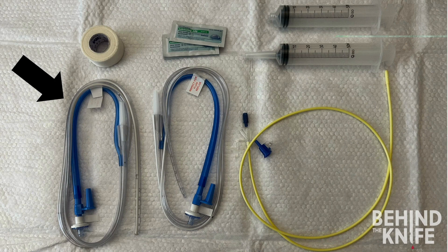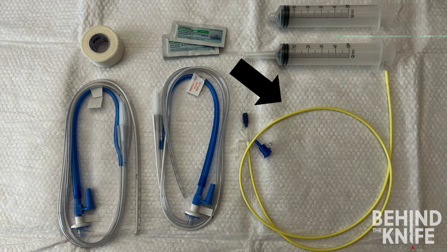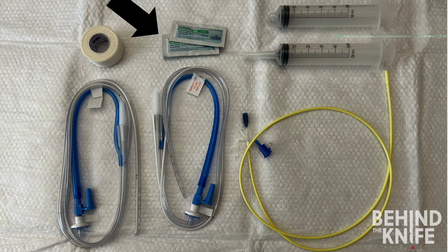The sump allows air into the stomach to prevent the tube from getting stuck against the stomach wall. The other type of tube is often called a small-bore feeding tube, such as a Dobhoff or a Corpak. These tubes have a single smaller lumen and are soft and more compliant. They usually have a weighted end and a wire in the lumen to stiffen the tube during placement. We will also need lubricating jelly, which will help us easily pass the tube through the nasopharynx and into the stomach.